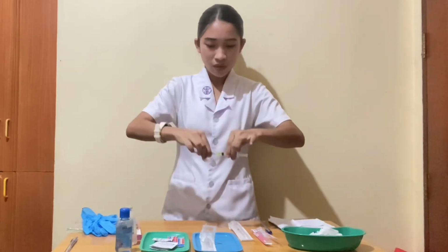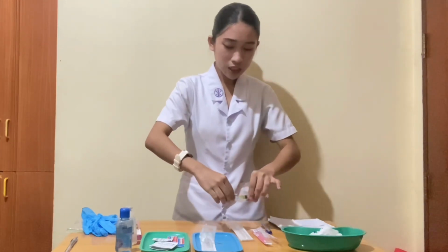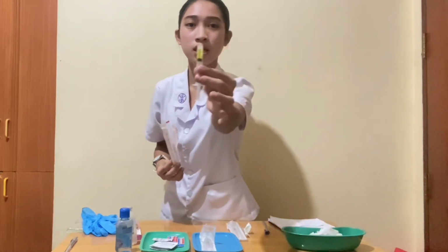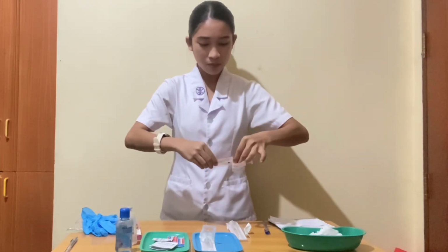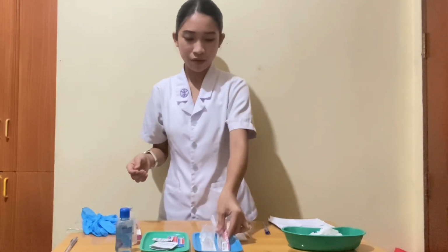And then remove the aspirating needle and attach it to the regular needle. As you can see, here is the medication. So I'm just going to attach this one and put it on our prepared tray.